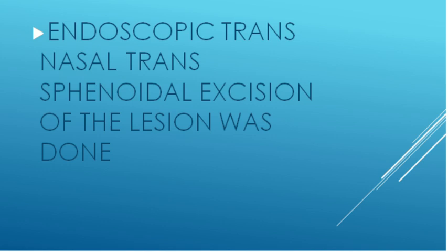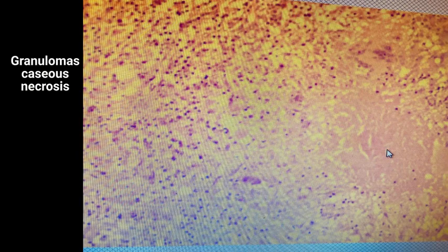For biopsy and decompression purpose, endoscopic transnasal transsphenoidal excision of the lesion was done, and not very surprisingly, the pathology report came as granulomatous caseous lesion with Langerhans giant cells, which was diagnostic of tuberculous granulomatous lesion.